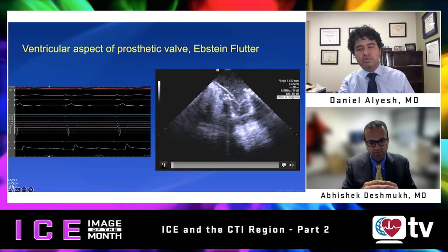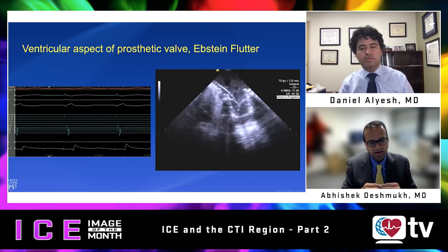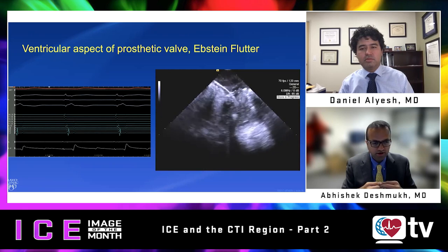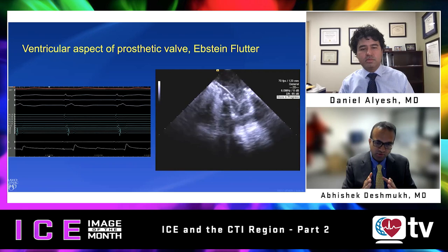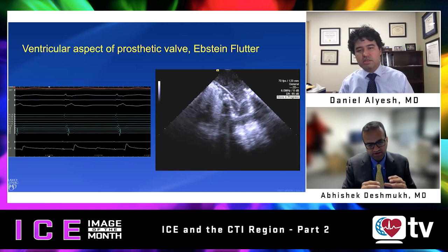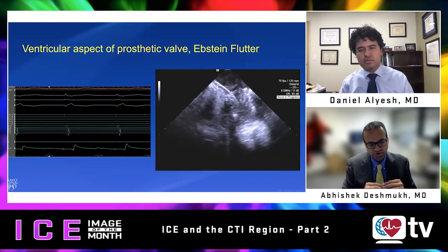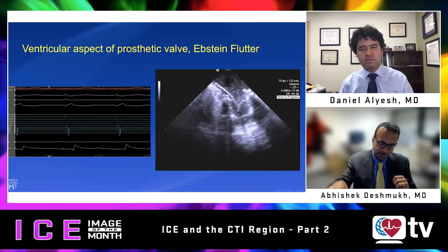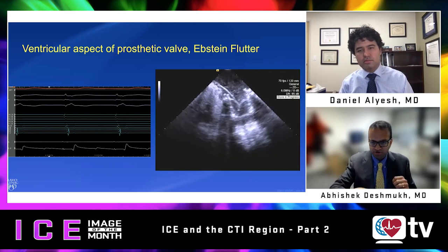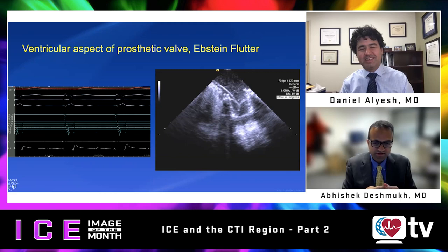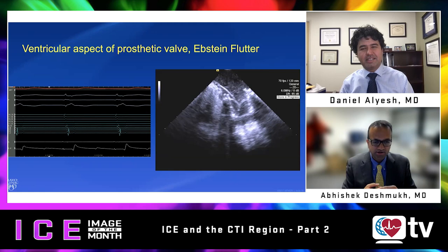This was an interesting patient with Ebstein's anomaly who had a bioprosthetic valve and then a valve-in-valve procedure. The patient had incessant right atrial flutter appearing to be cavotricuspid isthmus-dependent. If you just ablate from the valve to the IVC you will ablate atrial myocardium, but the valve might be seated more atrially, leaving some atrial myocardium unablated. In that situation, you may have to cross the valve and make a tight bend or knuckleball loop behind the valve to find atrial tissue, as shown here — the ablation catheter is beyond the bioprosthetic tricuspid valve and tucked underneath to see the atrial electrogram.